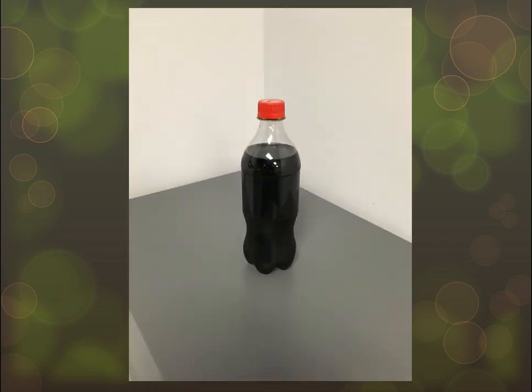Uh-oh, this one doesn't have a DICOM header. How do we know what that is? Is that a regular Coke? Is that a Diet Coke? Coke Zero? Vanilla Coke? Cherry Coke? Vanilla Orange Coke? I don't know. I can't tell you what it is because I don't have the DICOM header.